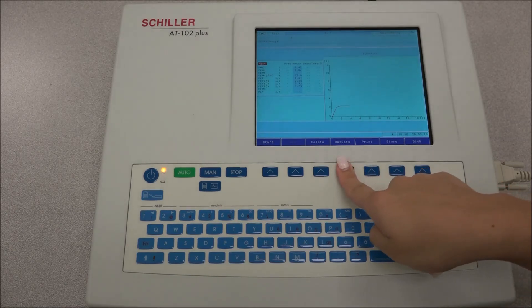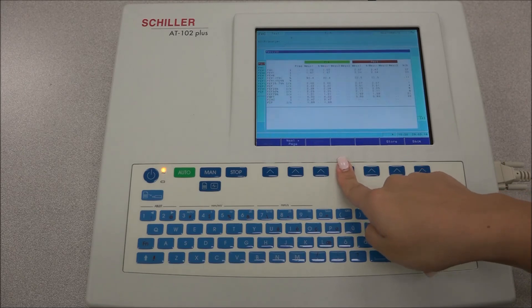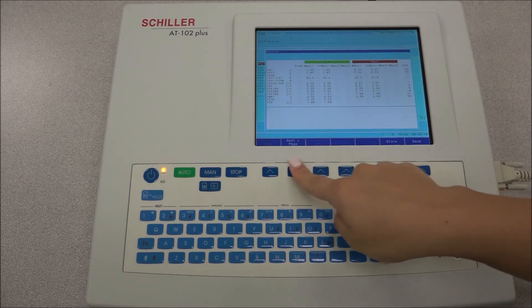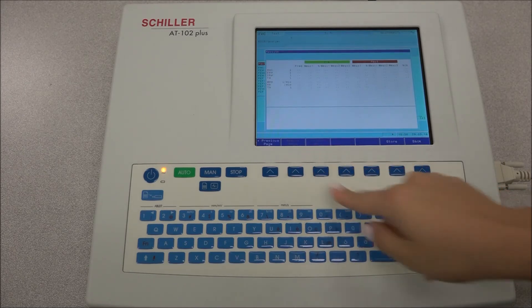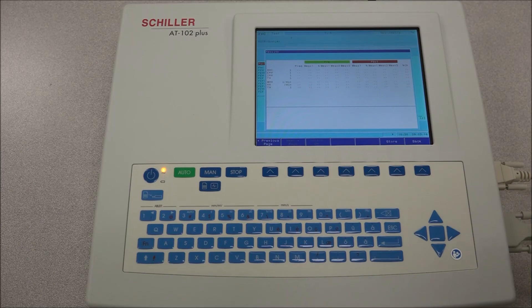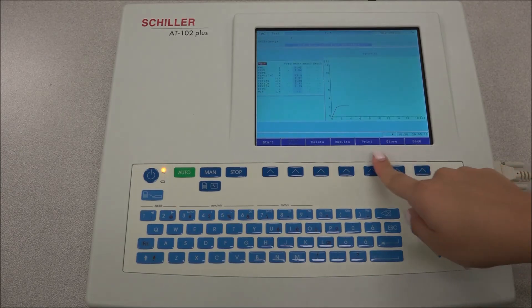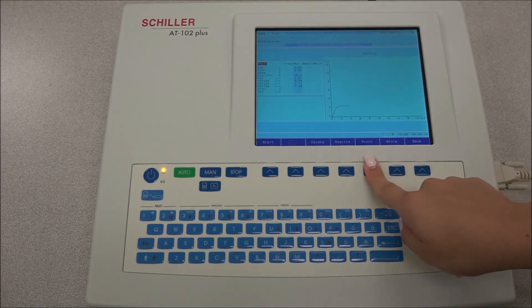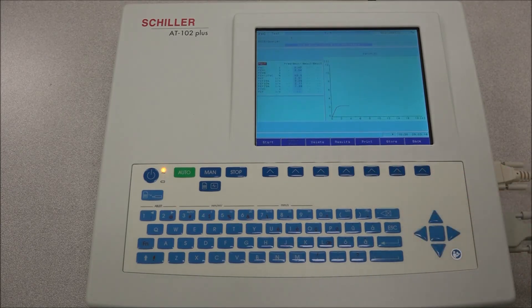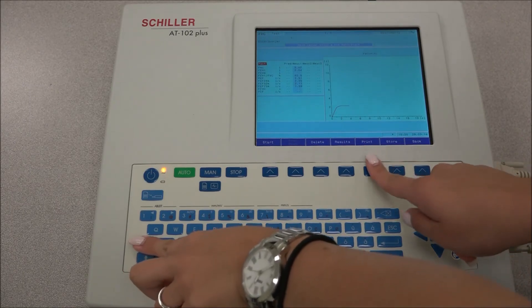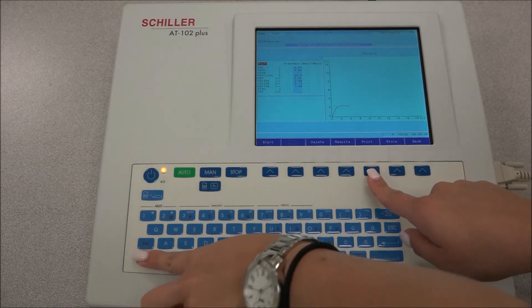The measurement table is displayed when the results icon is selected. Two different print data formats can be defined in the SPIRAL settings. To obtain a printout in format 1, press the PRINT key. To obtain a printout in format 2, press the FUNCTION key followed by the PRINT key.